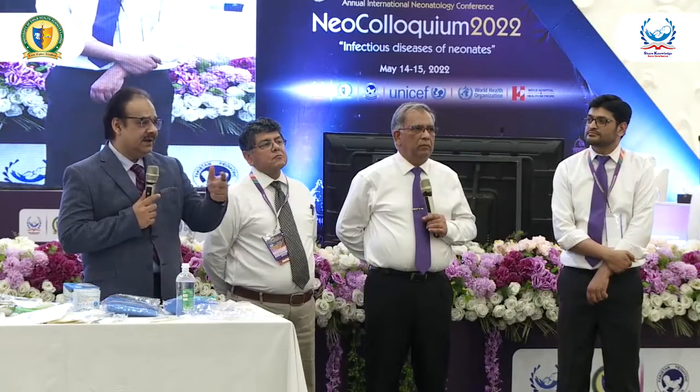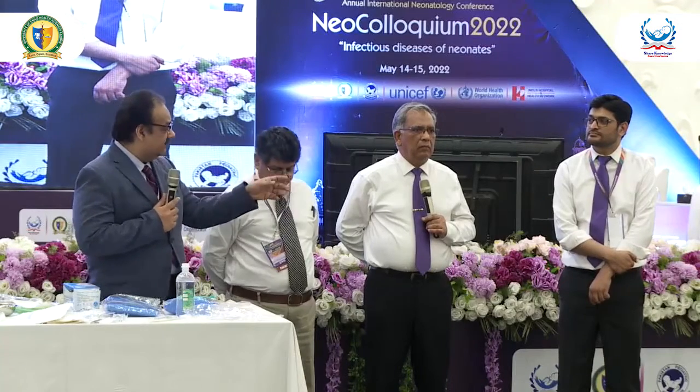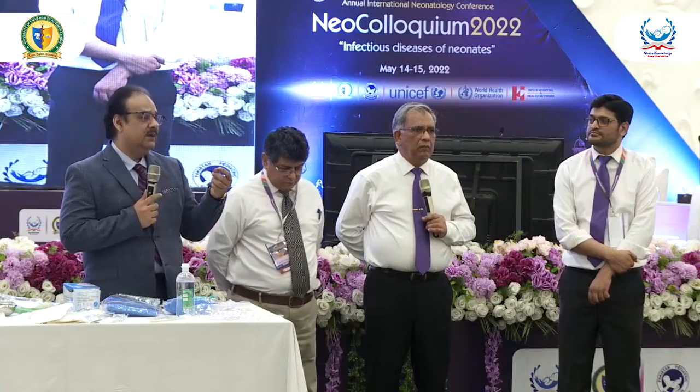Okay, so just send the two peripherally, as I showed. Because of the time, I am in a hurry, but you can take the presentation from the organizers. Take samples from the two sides, or if you really want, take a little bit from the central line. That's enough. Okay, thank you, sir.